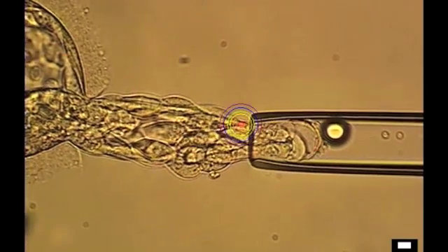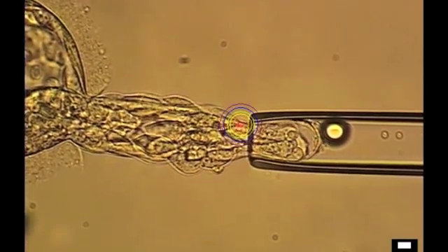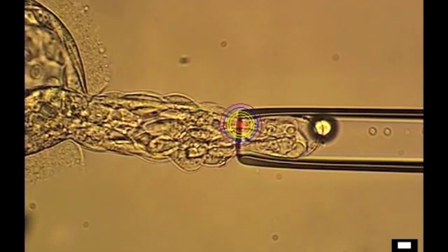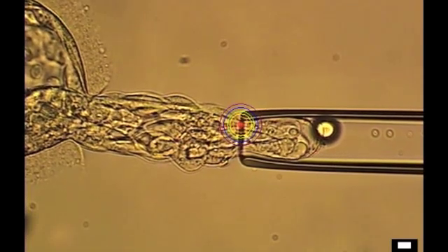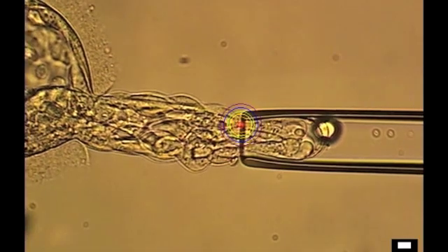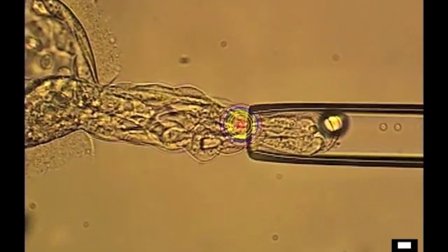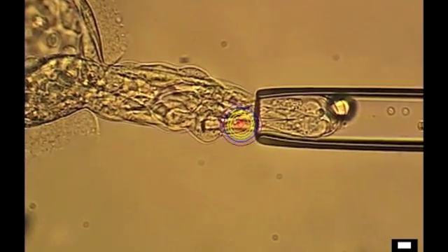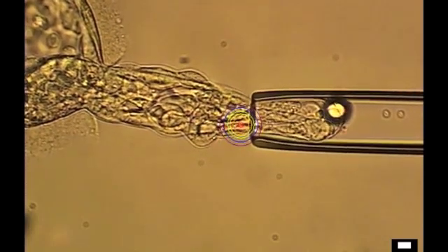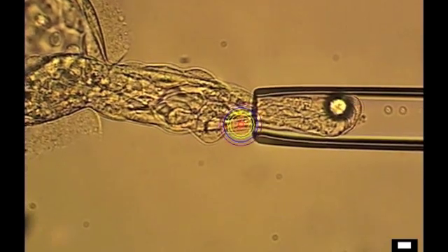The center of the screen shows a target, a circular-shaped image. The target corresponds to a non-contact microoperative laser that is used to remove, by a series of pulses, about five to six cells of this trophectoderm material.